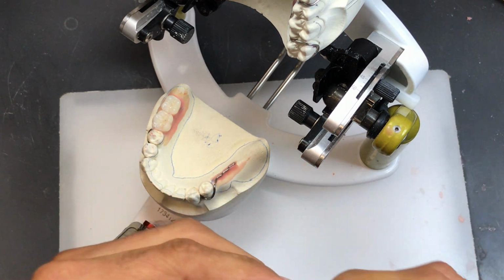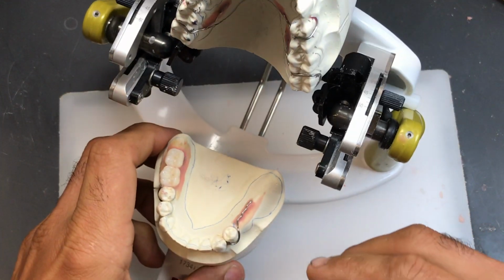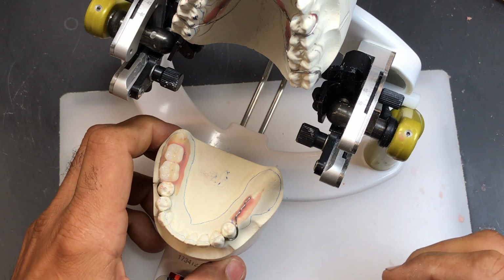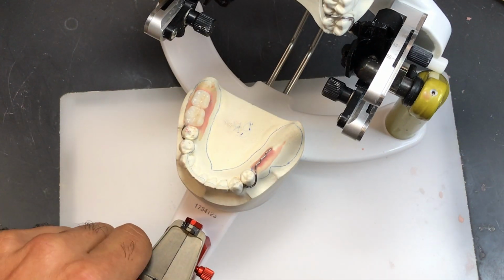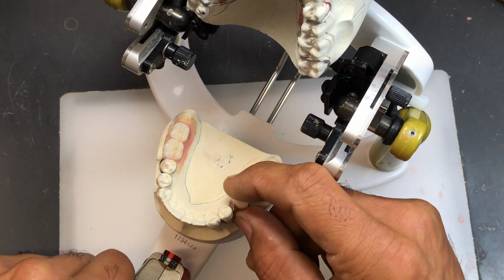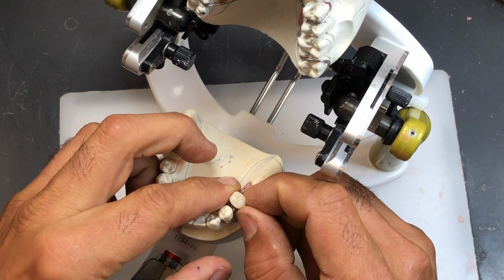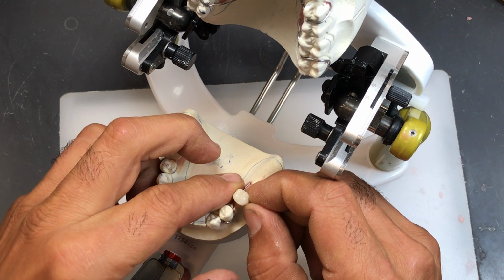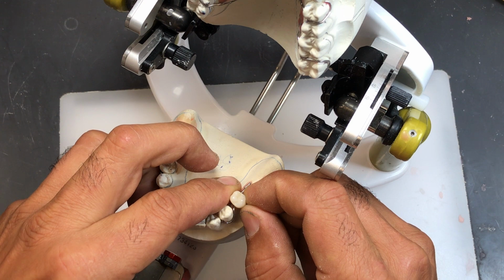And once again, I'm going to tentatively hold it into position and see how it fits. So that's where I want to go, but obviously the wire is in the way. And where do we grind now to compensate for that wire being in the way?